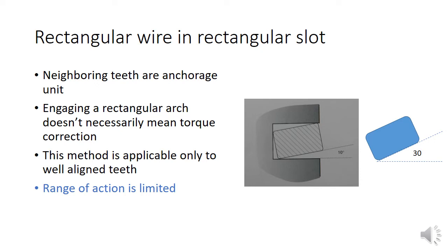Also, twisting the wire about its longitudinal axis and to the correct angle without bending the wire in other axes is considered a very delicate task.